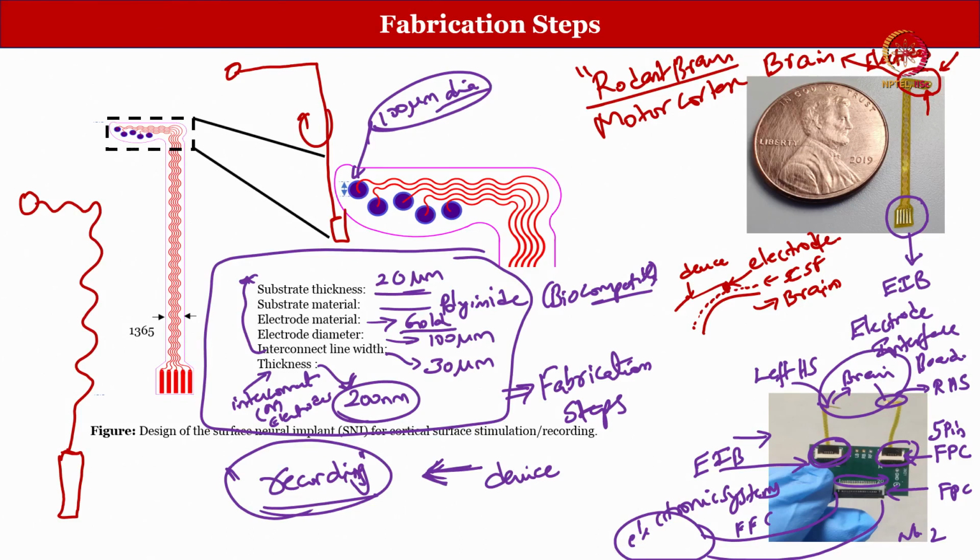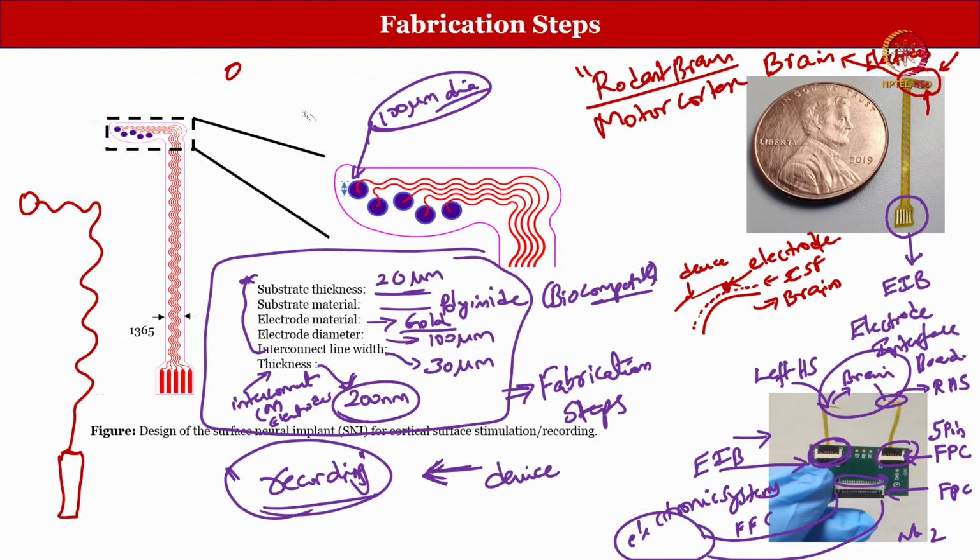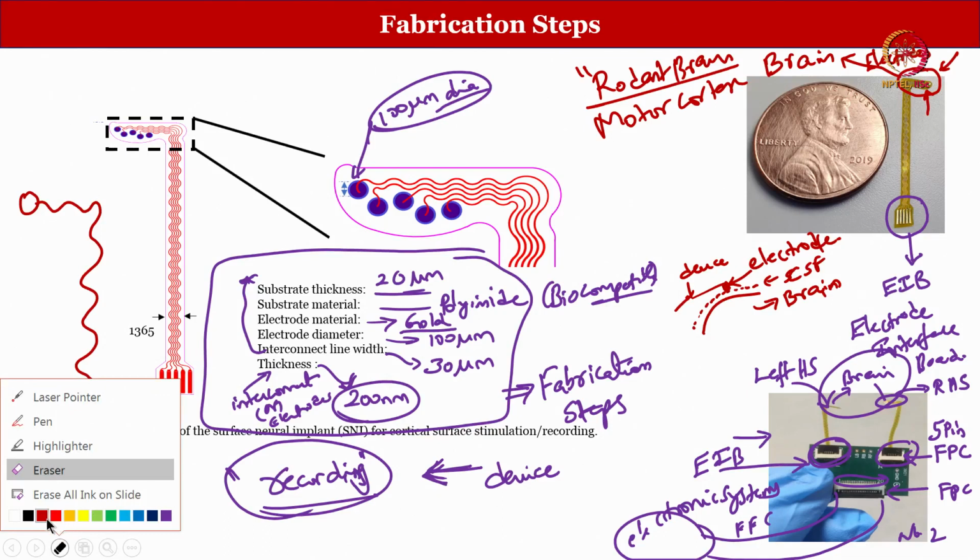And in the next slide I have some photos to show you how that looks. When you bend it and the interconnect becomes straight, there is a chance of breaking it. So, we do not want that. We will use a serpentine shape to accommodate those stresses. That is one of the reasons; there are multiple other reasons as well. I am just giving you a brief about that.